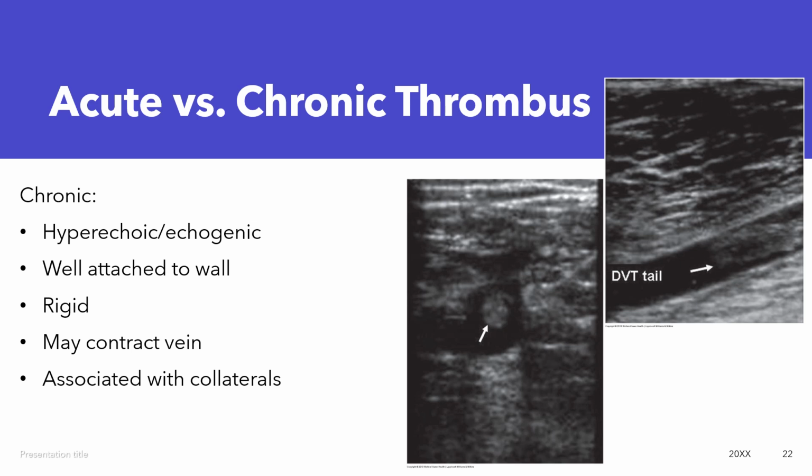If you've had this for a long enough time, eventually it'll give up on moving flow through that area and could probably create some collaterals. And in that case, because of the decreased venous pressure in that region, it would allow the vein to just sort of collapse around the chronic thrombus, as you're kind of seeing here. Here's a vein, perhaps here's the clot within it. This clot's been there a long time, perhaps long enough for some collaterals to bypass the clot. And when that is the case, then the vessel walls will collapse because it no longer is providing a lot of pressure to this area.